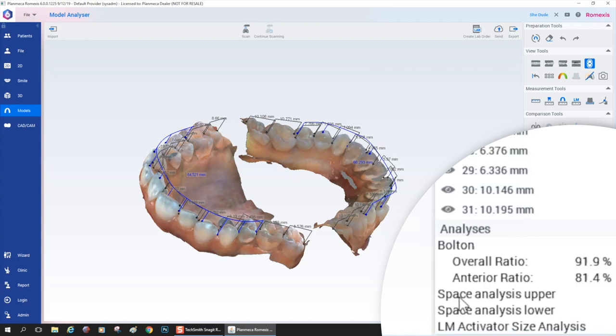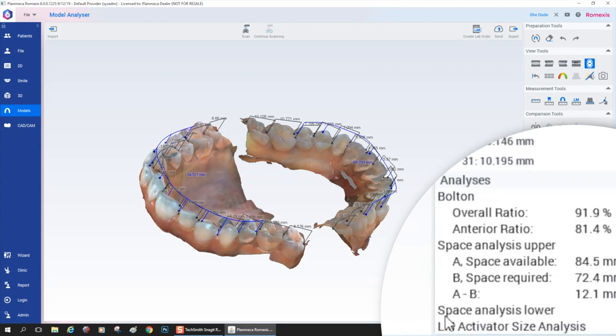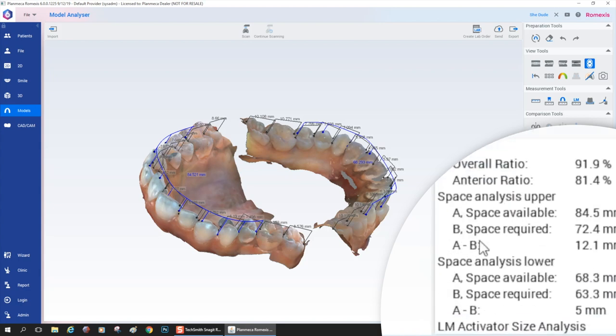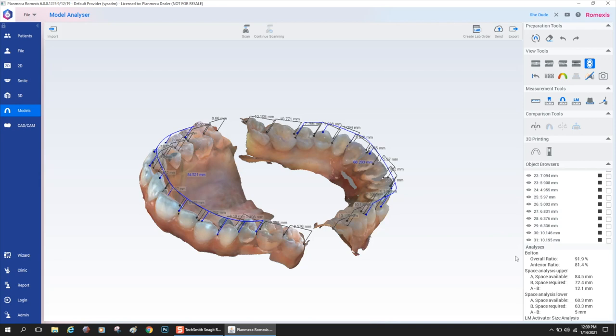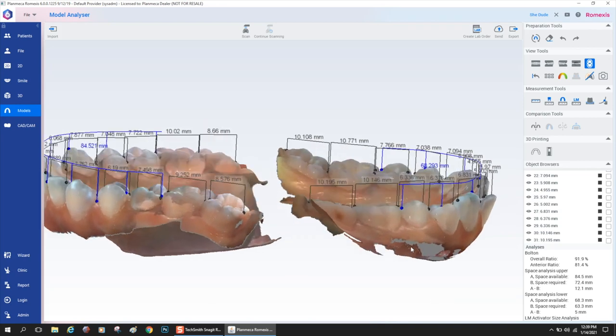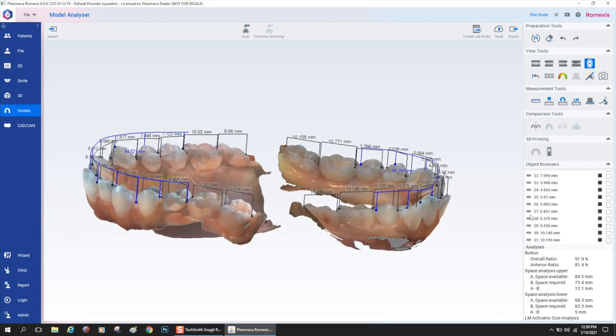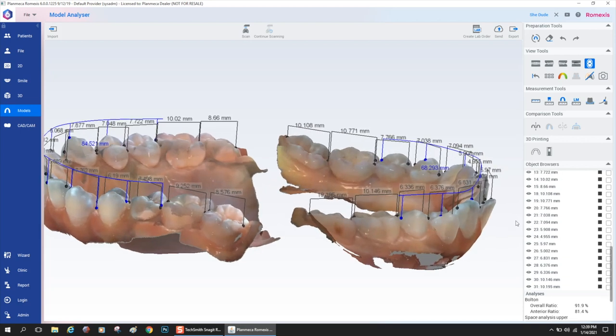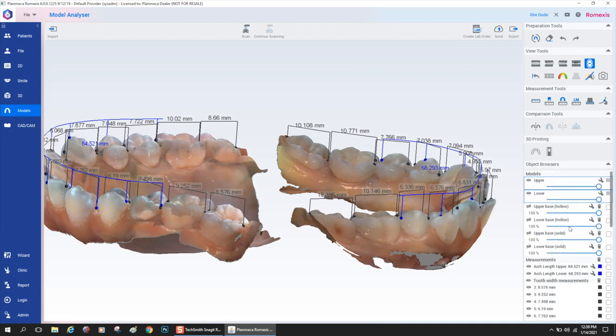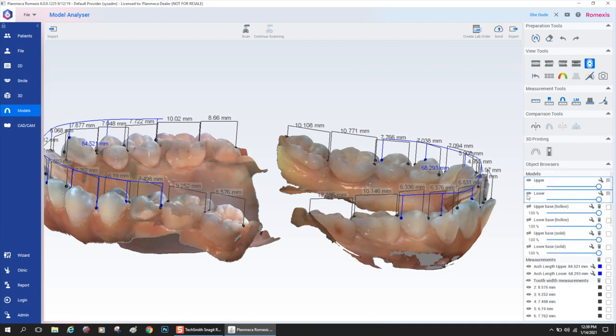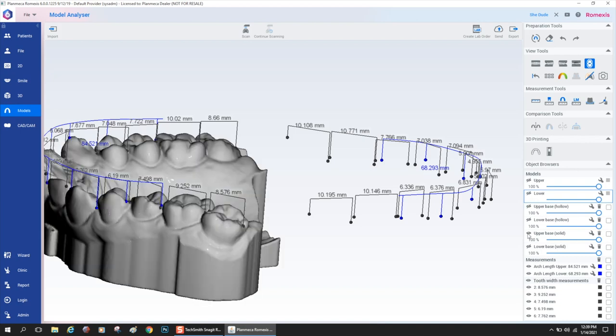You can see that skeleton is taller than the tooth measurement skeleton and it's blue color. All your measurements are down at the bottom. You could just click and instantly it's going to do your Bolton analysis, including the anterior ratio. It's also going to do a space analysis for the upper arch and lower arch, all instantly measured and calculated for you, which is really cool. I use this all the time for any cases that I'm going to do clear aligners on.